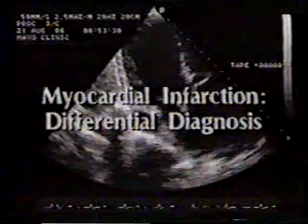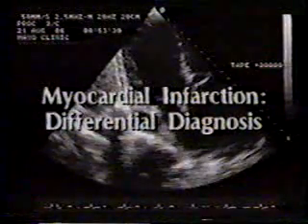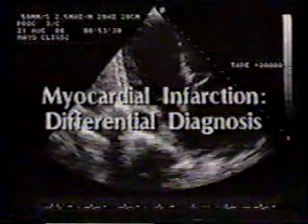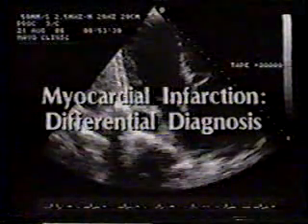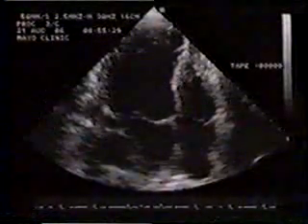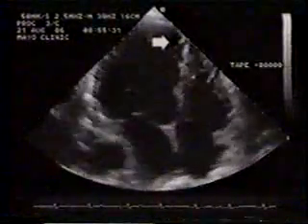As the patient with severe chest pain presents to the emergency room or is admitted to the CCU, echocardiography not only allows us to diagnose myocardial infarction and its complications, but also allows us to sort out other conditions that can masquerade as myocardial infarction. This patient presented with myocardial infarction. There is mild apical septal dyskinesis.